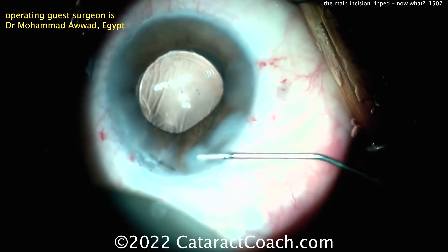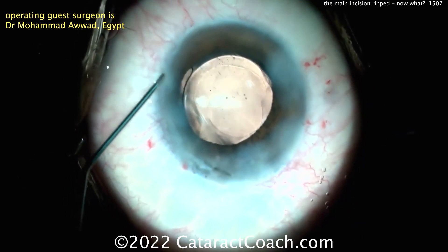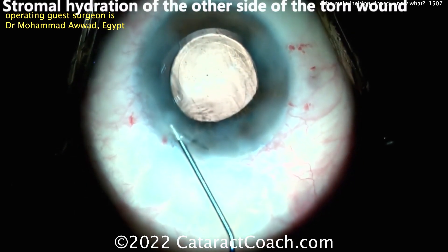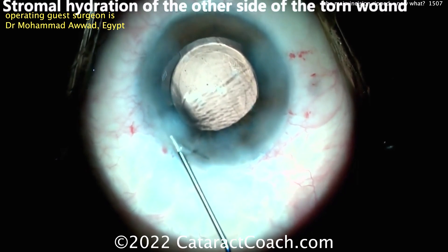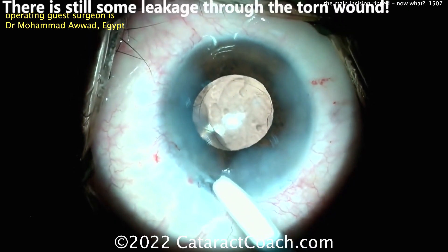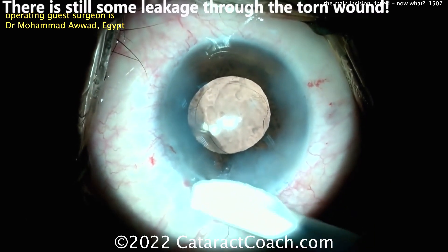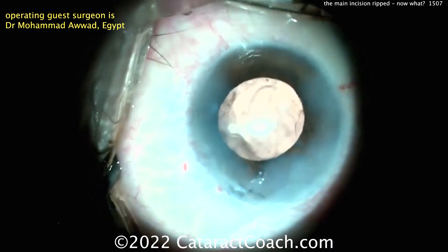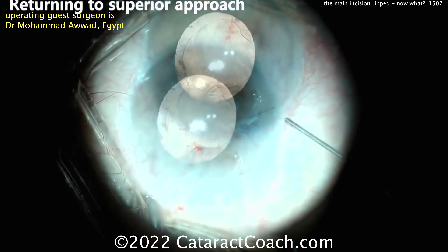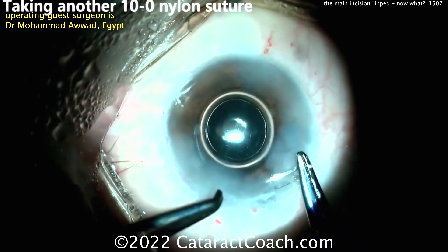Let's look at the end here. Sealing up the incision — the second incision is okay, the other paracentesis looks fine. Now let's go back and look at the first incision that ripped and see what we can do there. A little bit of stromal hydration, and it's probably still going to leak. So you're probably going to need some more sutures — try to put some radial ones in. Intracameral myochol going in, that's reasonable. Still some leak through that torn incision, so it may need more sutures to seal it up. You definitely want it absolutely watertight when you're on the OR table. The surgeon is moving the scope, making sure you can get a nice absolutely sealed incision there from the original leaky one.